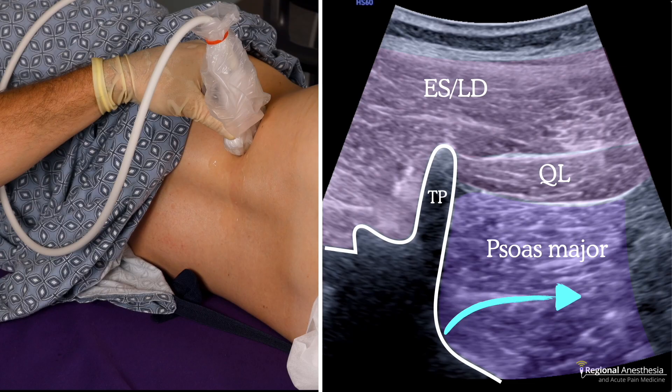The roots are sometimes visible as a bright streak within the muscle, but not always. The needle trajectory aims for the posterior medial quadrant of the psoas muscle. You'll want to slightly shift the probe cephalad or caudad to get out of the way of the transverse process to accommodate your needle. Because we don't see the plexus routinely, we'll always combine ultrasound with nerve stimulation to ensure we're in the correct plane.